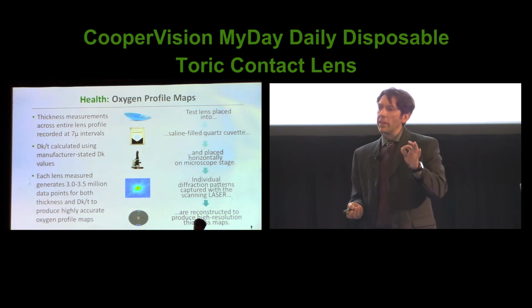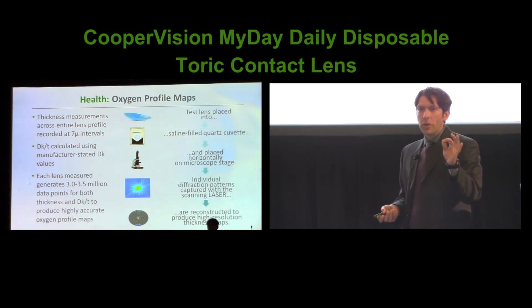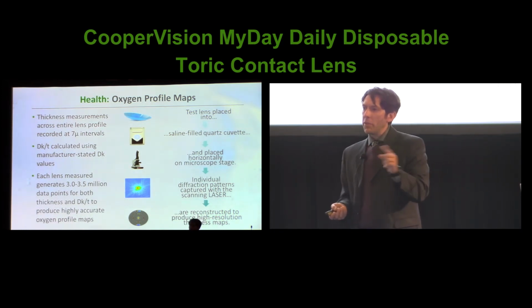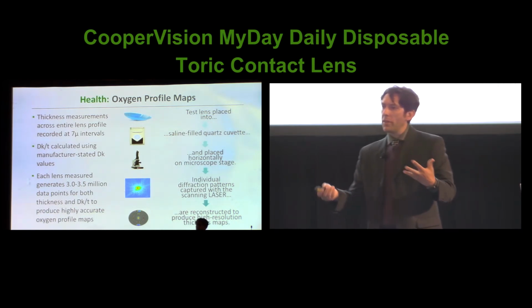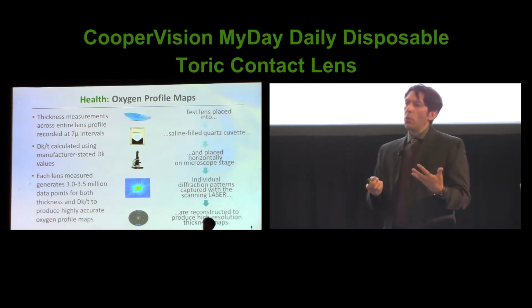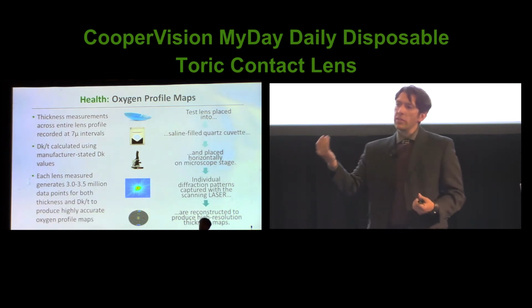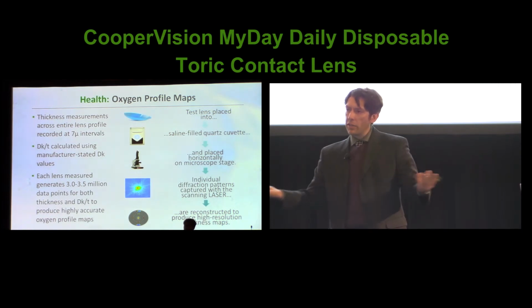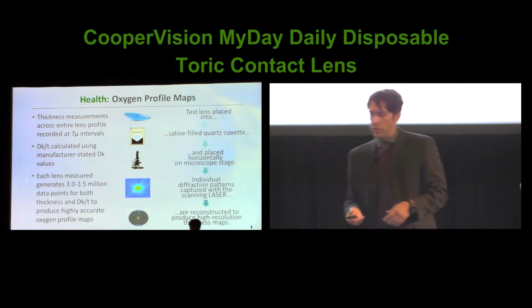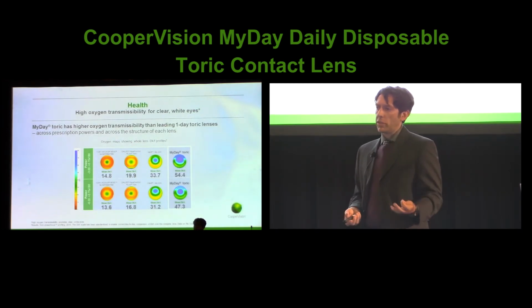Okay, and to put that in context, the thickness of an average human hair is 50 microns. So across the thickness of one of your hairs, they'd be taking 7 measurements. So that's the level of detail at which we're able to determine thickness of a contact lens. Now, of course, we know the DK, or oxygen permeability, of all contact lens materials, because that's a published value. So taking this thickness map and the DK of the material, we can then create an oxygen map across the entire contact lens surface. And so when you do that, then you get the whole picture.